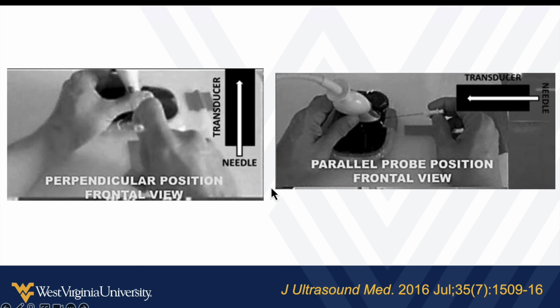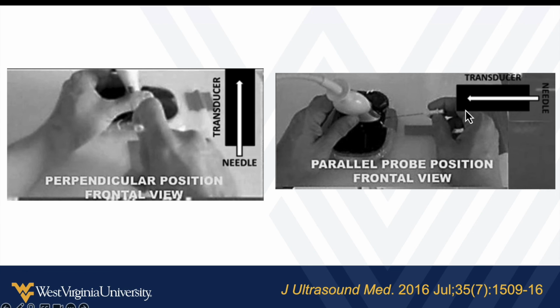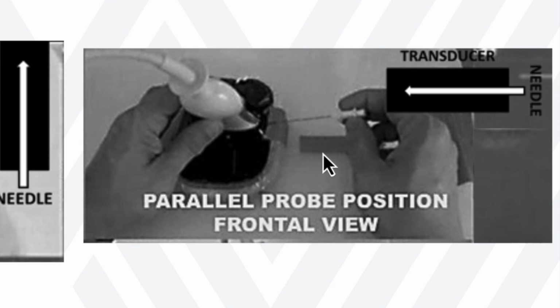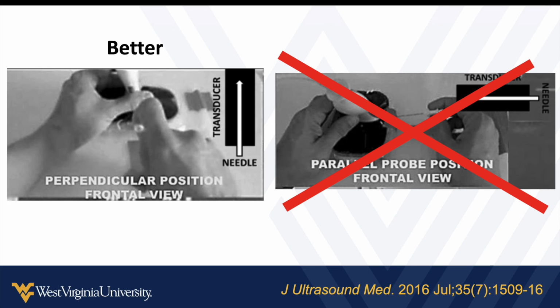Now this is something I talk about with all ultrasound guided procedures. You want to be in this direction, perpendicular, where the needle is going away from your body. You have a little bit better stability, a little bit better control, and your accuracy is improved when you're driving the needle away from your body versus this sideways thing where the needle is crossing in front of your body as you go. This is less control, less success, a little bit harder to do versus driving the needle away from you. So this is what you want to do. This is not what you want to do. So before you even start, set your ergonomics up and set your positioning up so that you can be driving the needle away from you.